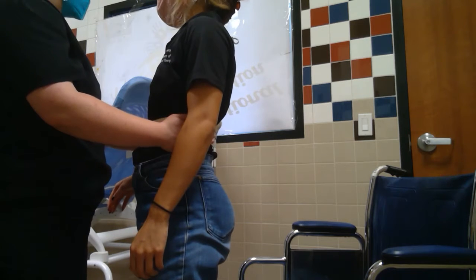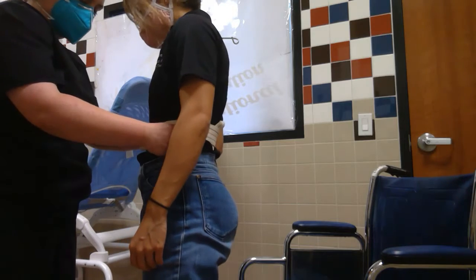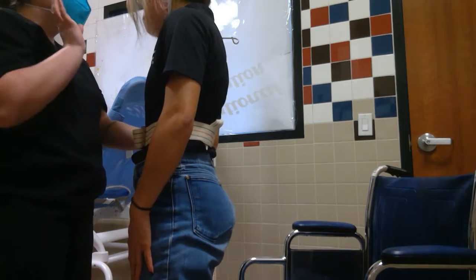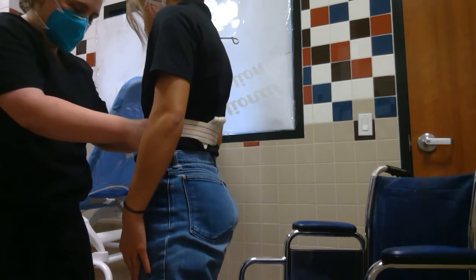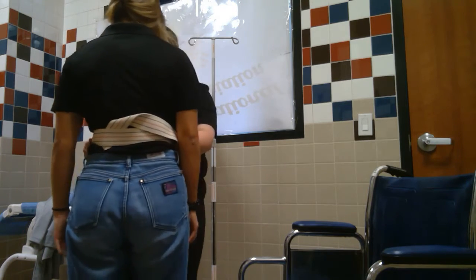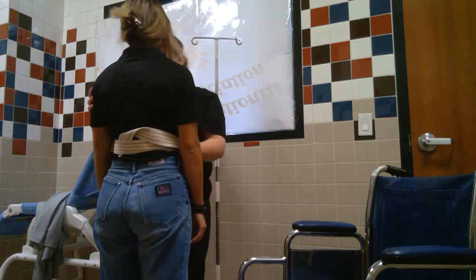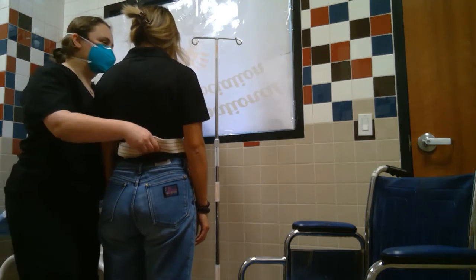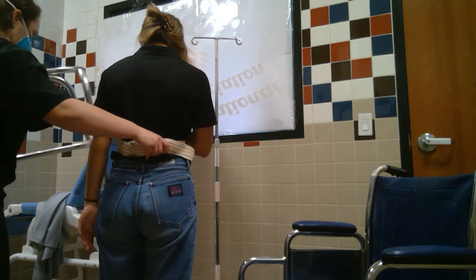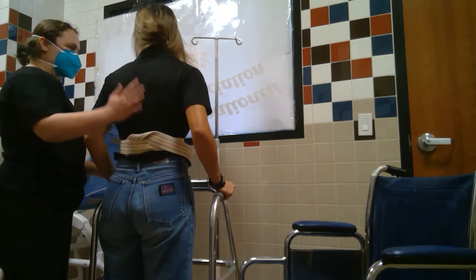Alright, so now what we're going to do is we're going to walk over to this hanger right here, okay? And I'll be right here with you. But remember, when you're walking, you're going to lead with your weak leg first, okay? And just take small, slow steps. Alright? So now we're going to turn. Like this? Beautiful. Alright, we're going to stop right there. How do you feel? Alright, I'm going to come get you the walker so you can kind of hold on for balance, alright? Oh, this thing is in the way. Alright, feel good? Yeah. Good?